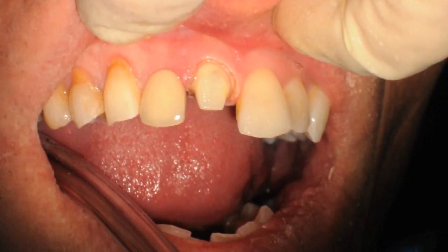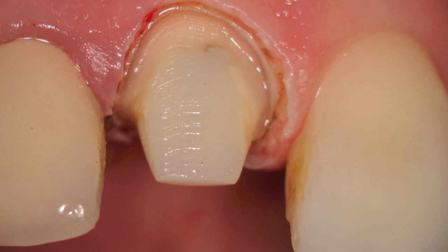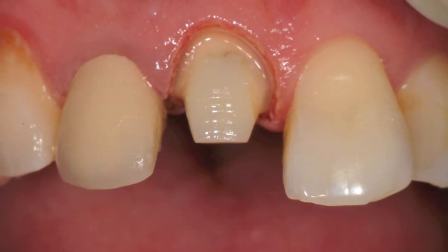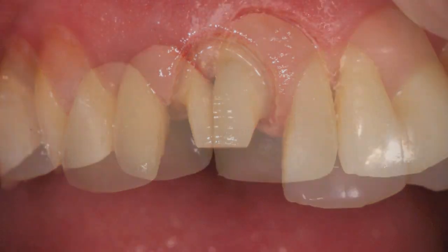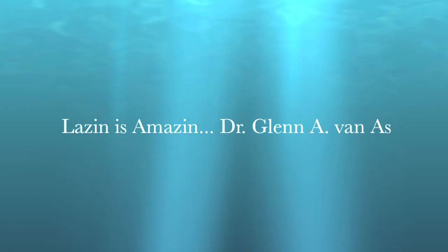Immediately post-operative at low and high magnification, you can see the central and the result just before taking the impression. Here we are with the tooth and finally the provisional placed. This is Dr. Glenn van As saying keep lazing — it's amazing — and until next time, goodbye.